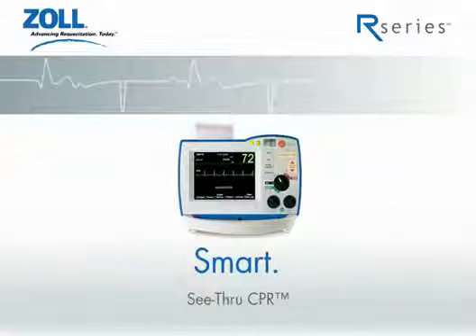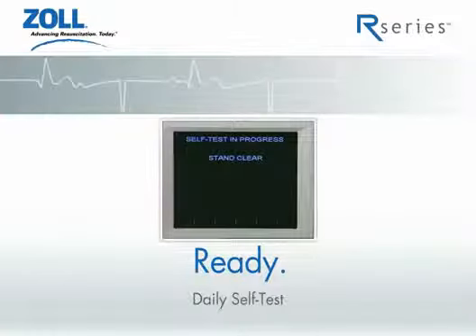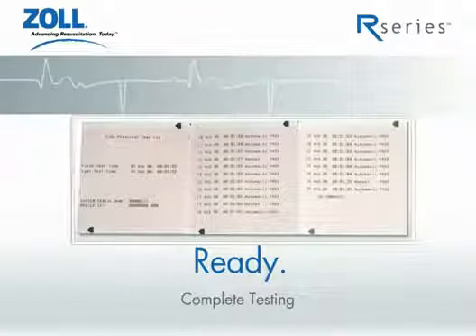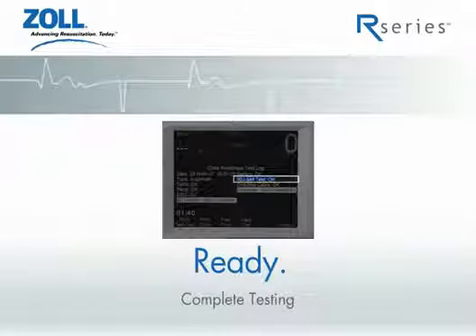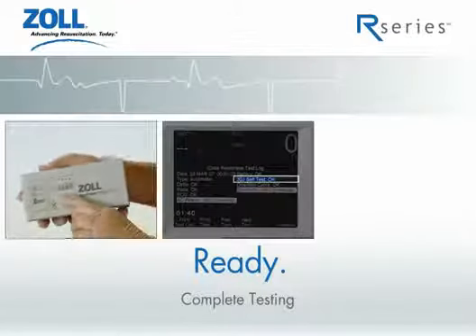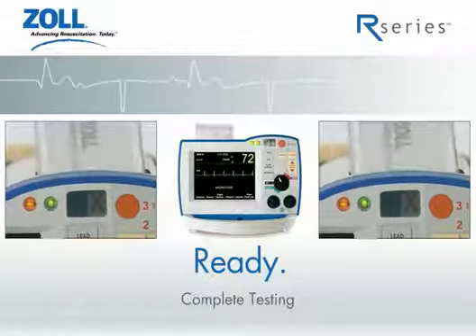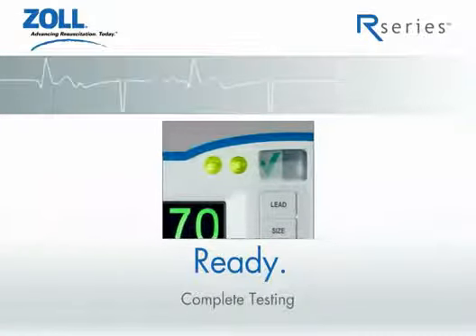The R-Series is also the only device that is always ready. The first part of being ready is the ability to conduct a daily self-test without the need for a separate test block. The second part of being ready is the ability to test complete functionality: the ability to deliver a shock, defibrillation, pacing, ECG, and CPR circuitry, all cables, and battery charge level. The final part of a ready device is the ability to tell at a glance that everything is okay. The green check mark combined with green LED lights indicate that the device is plugged in and the battery is fully charged.